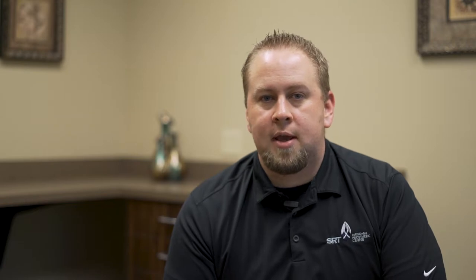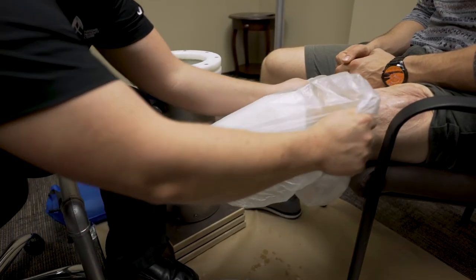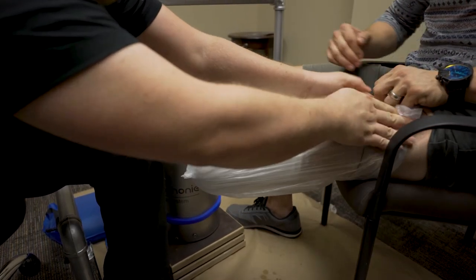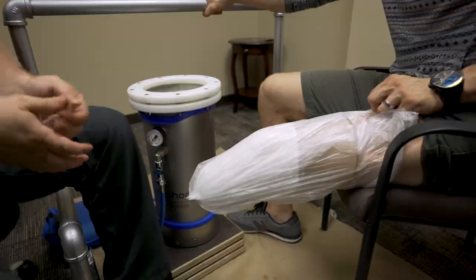After the plaster bandage has been applied to the limb, place a trash bag over top of the cast material. This will ensure that the limb slides into the Symphony Aqua system appropriately, as well as keeping the tank clean through the casting process.